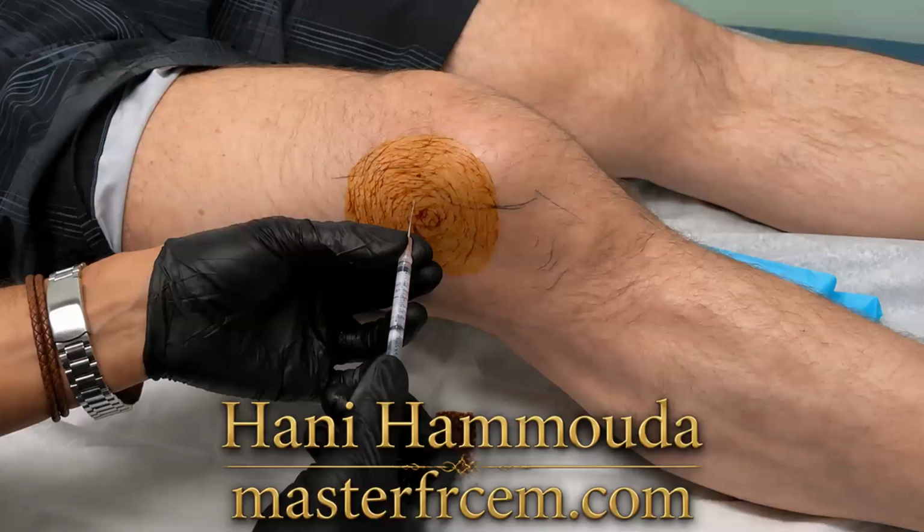And also you have two needles. This one is small, so 23 or 25 gauge cannula. This is for injecting lidocaine subcutaneously, so skin and subcutaneous, so superficial. Clear, doctor?